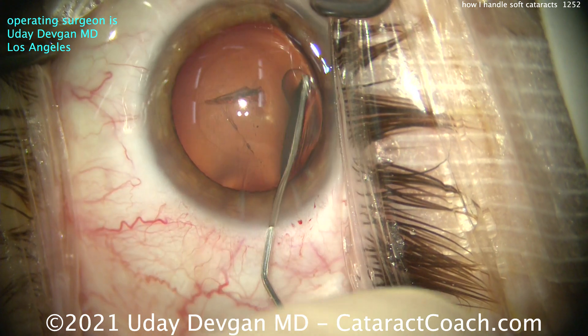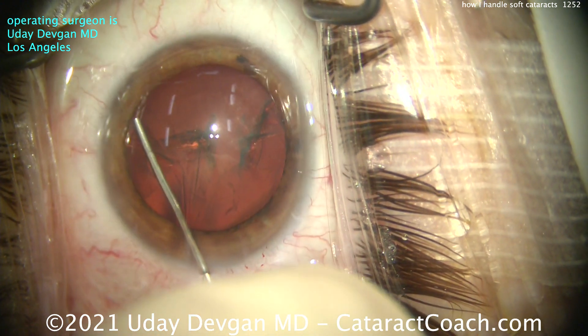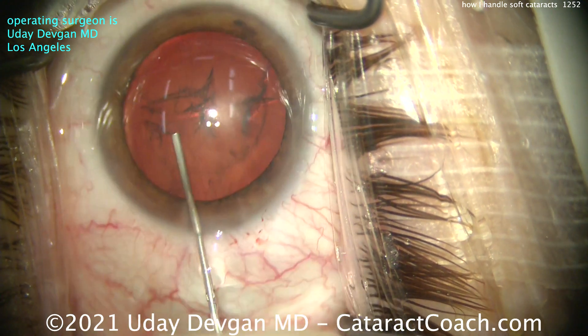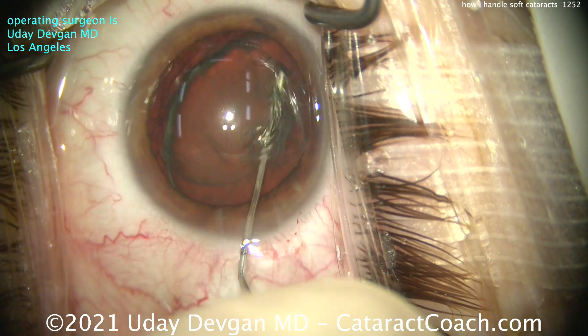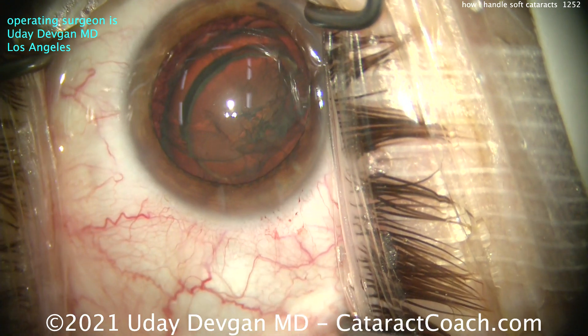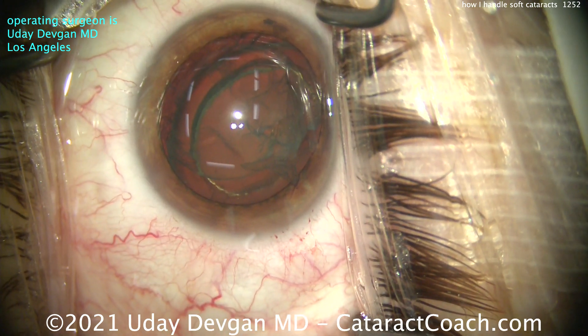Here comes the hydrodissection — this is the key. Check it out: fluid wave, and don't stop. It's not forceful; it's very low pressure but continuous. Wave after wave after wave to get the nucleus up. And I don't stop — delineate. Look at that. Now the whole lens is up away from the capsular bag.